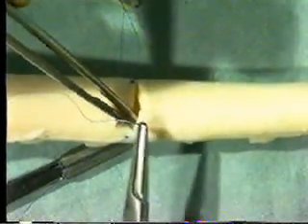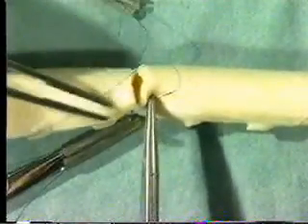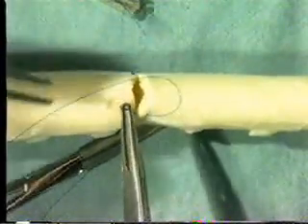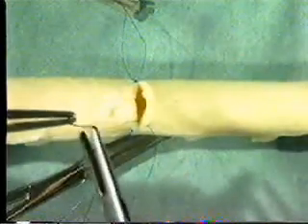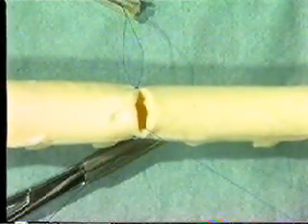Take the other needle and begin suturing from outside to inside on the upstream side of the incision. Then suture from inside to outside on the downstream part of the incision. This is because intimal dissection is most likely on the downstream side once blood flow is restored.